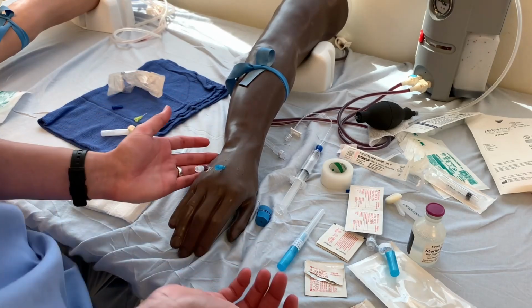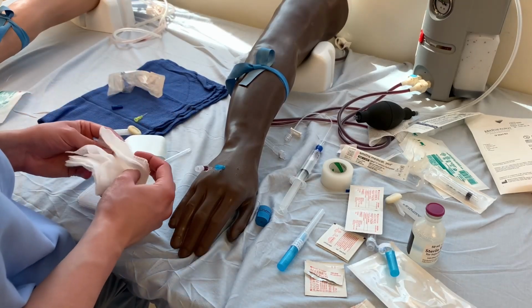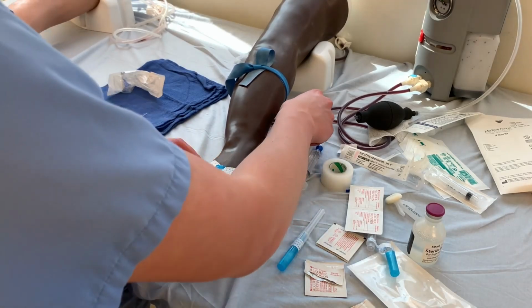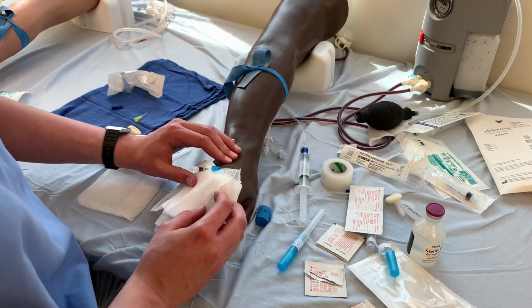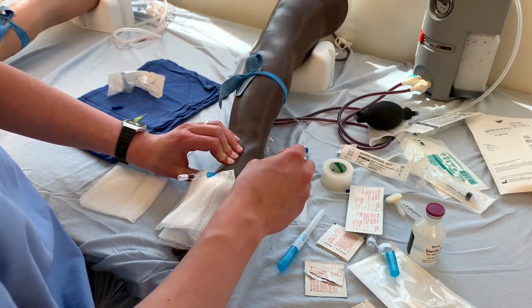And there we go. Now again, you're not just going to want to let it sit there. This is just because there's a camera. Put a little piece of gauze there if you'd like. Some people prefer it. You're going to want to occlude the vein. And again, some people pop the tourniquet here. I've seen people do it. I've seen people not.